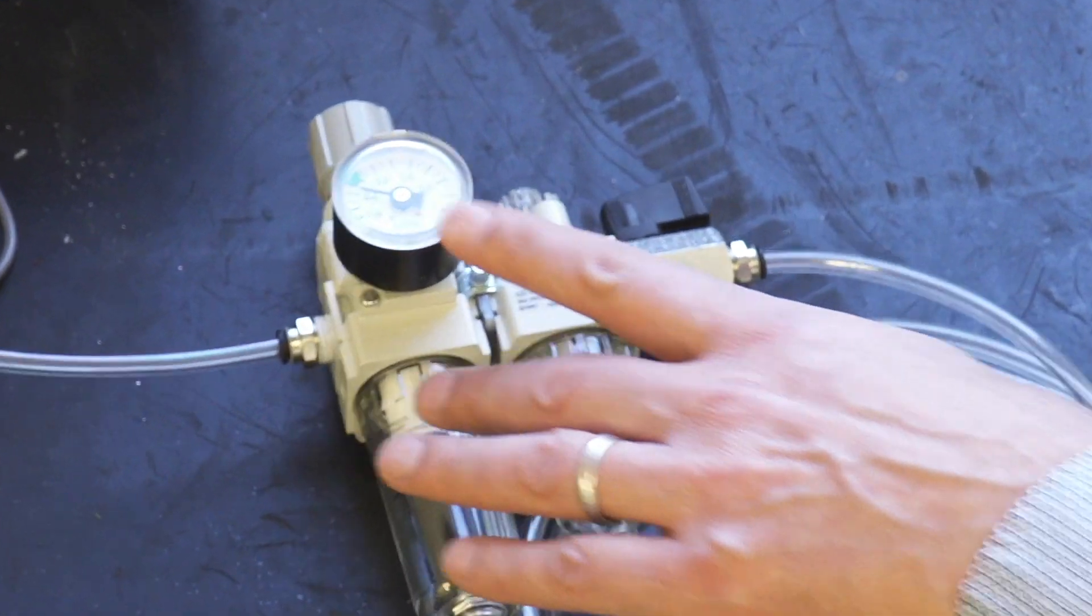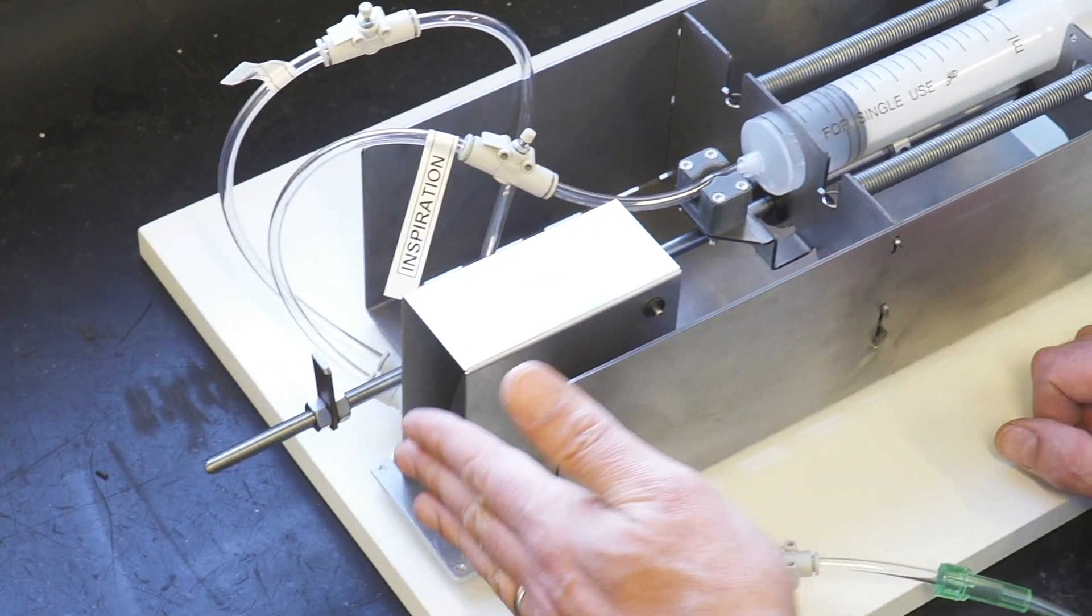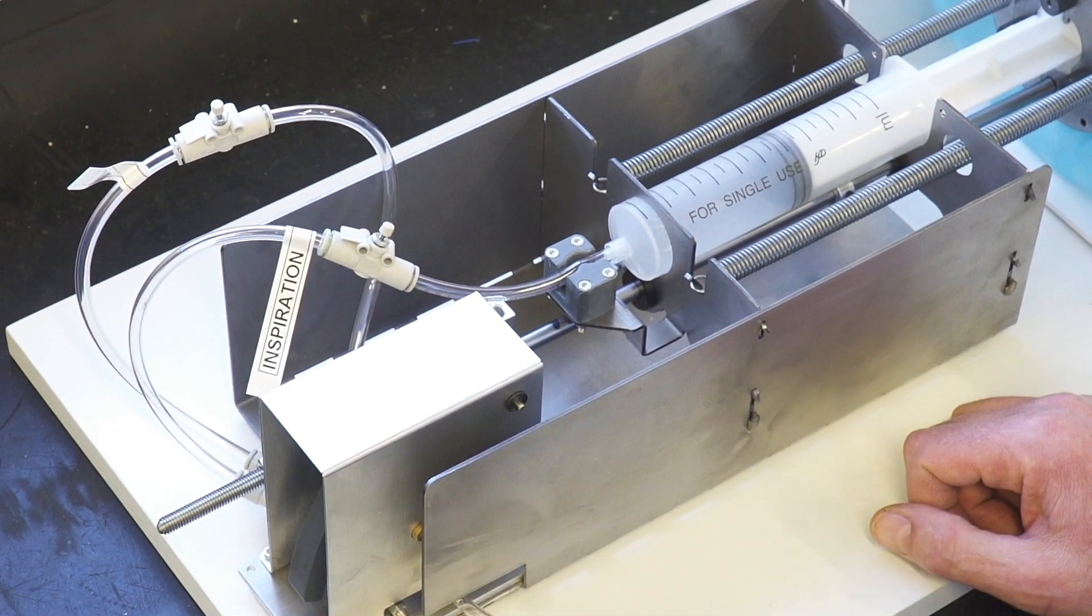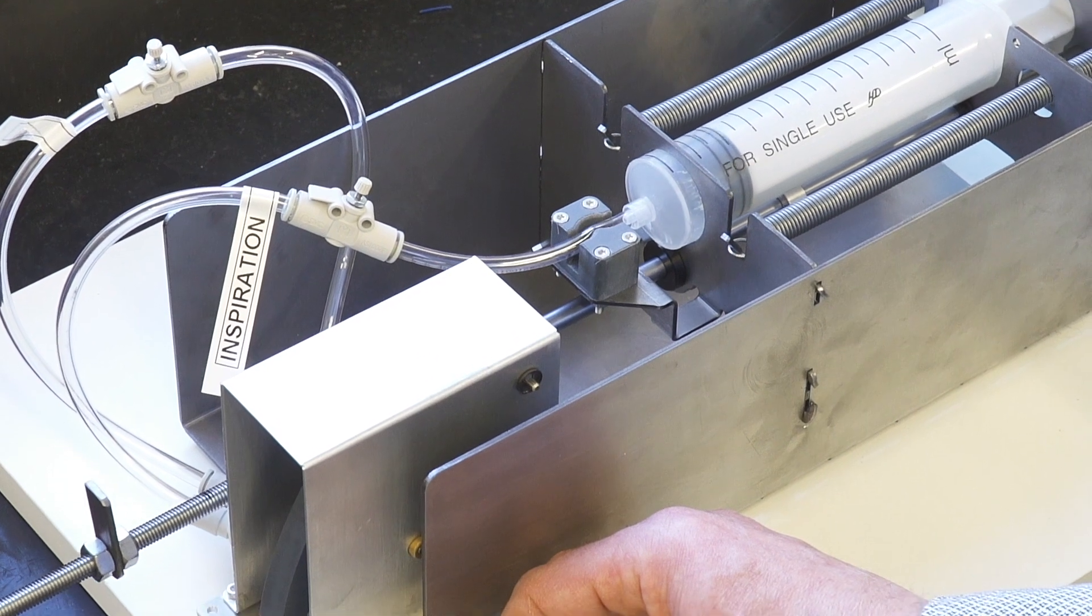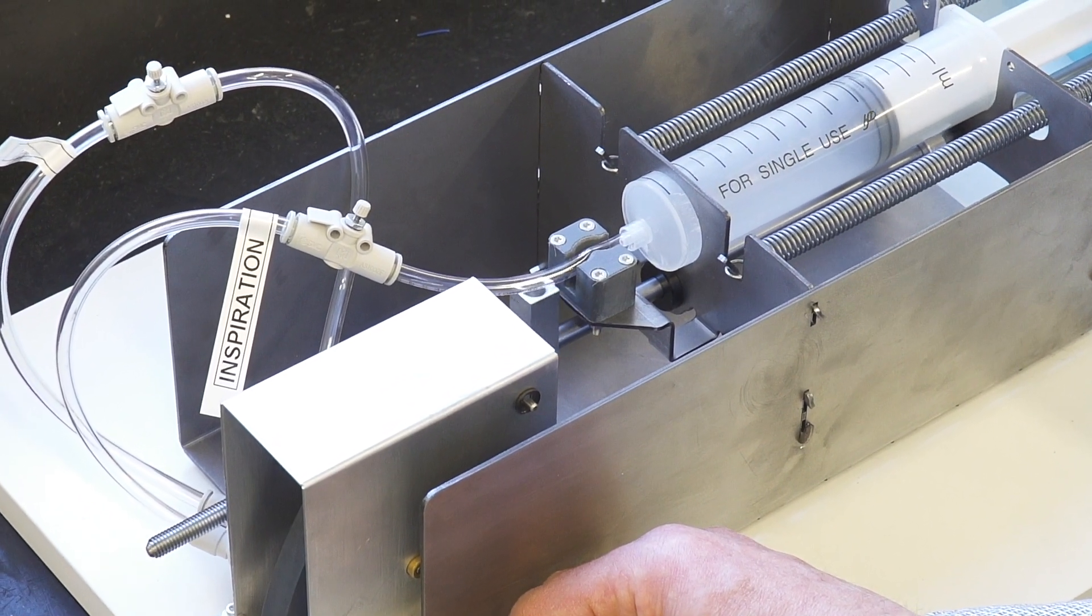Now the first thing that we do is we set a constant pressure. We're running this at 0.2 megapascals. We've set these stops for a stroke of around about 80 millilitres.